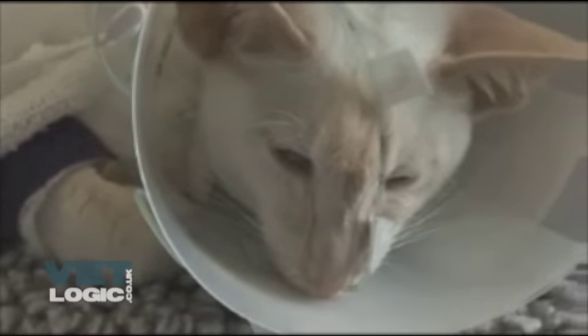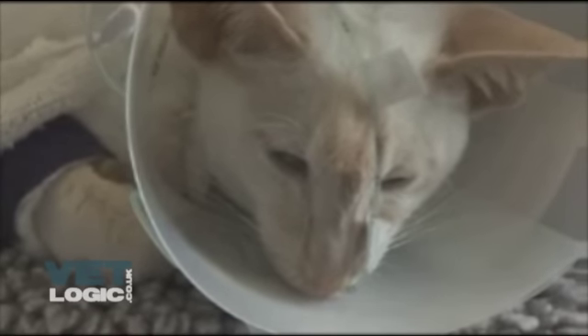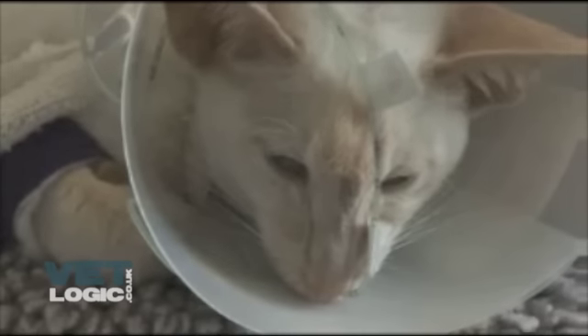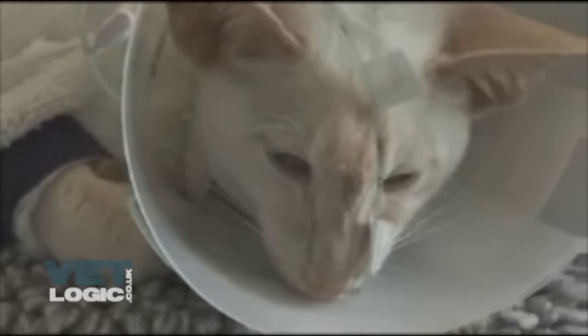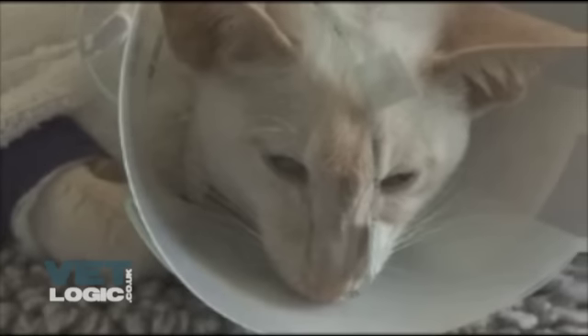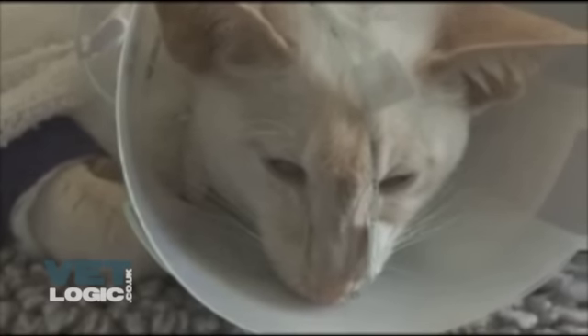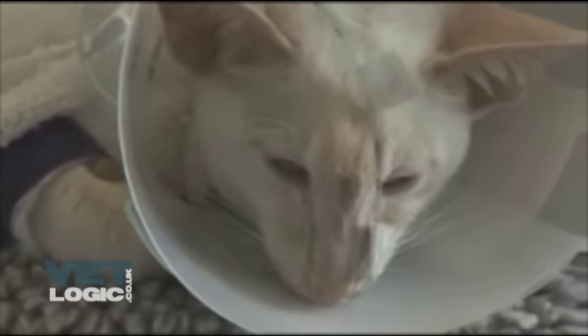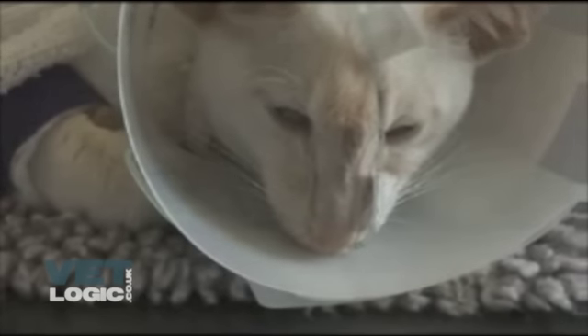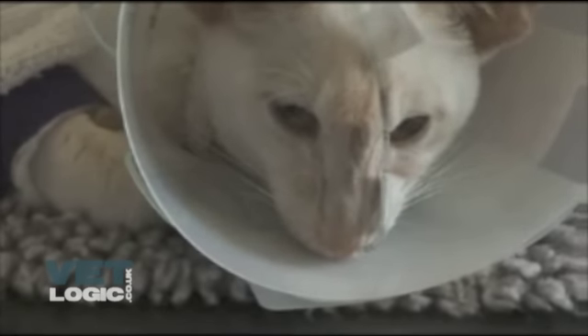The tube can be secured to the patient by attaching two pieces of tape to the tube to make butterfly wings — one approximately one inch from the nose and another two to three inches away. A small amount of glue should be applied to the tapes, with one stuck in between the eyes and another on top of the head. Ensure the tapes are stuck onto hair, as directly onto the skin will cause burning and difficult removal.